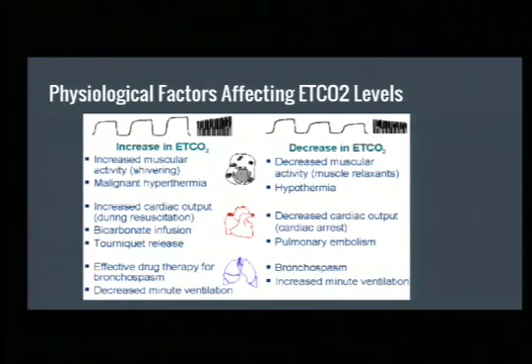If you give bicarb, or if you release a large tourniquet. So not an IV start tourniquet, but you put one on their thigh for a big arterial bleed, and that gets released if they were intubated at the time, and during that release, due to that cellular metabolism, all that lactic acid, and that whole cellular process, you'll see a transient increase in your end tidal.